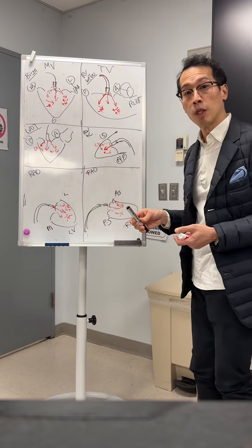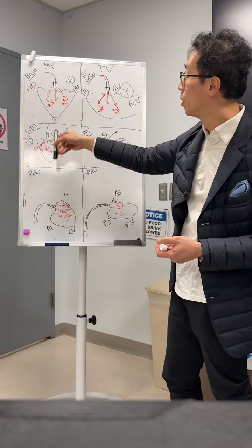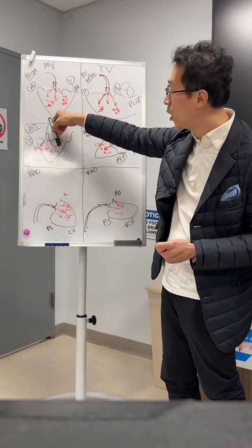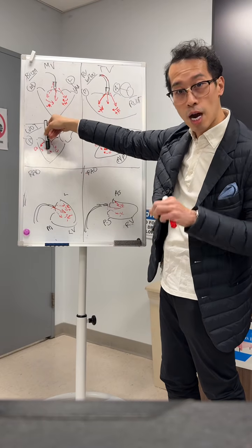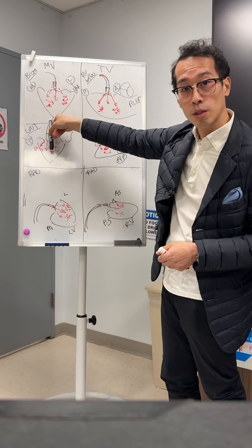Now, on the grasping view, you can't tell on fluoro. So what you have to do is look at echo. On echo, you should be going straight. If you start going towards the anterior leaflet, you need to clock the guide posteriorly. If you're going towards the posterior wall, you counter-clock.